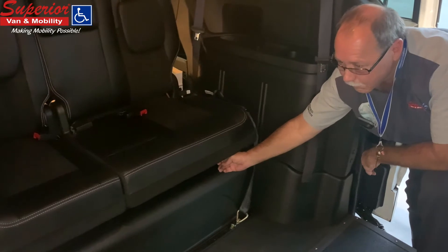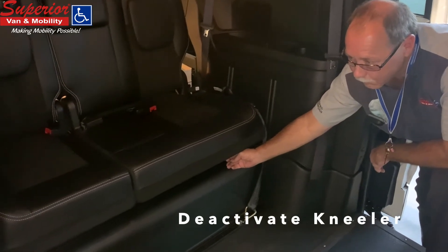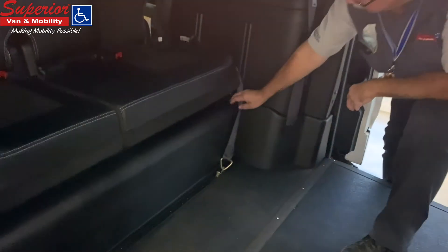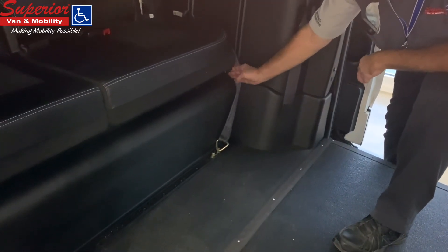On newer models, you can deactivate the kneeler by pulling up on a toggle switch located to the left of or under the driver side of the back seat. This will release the kneeler to the up default position.